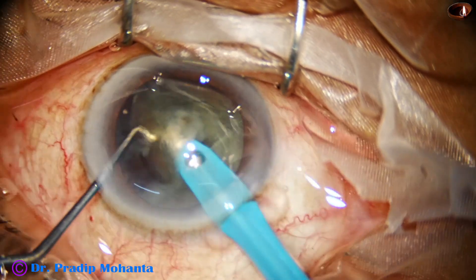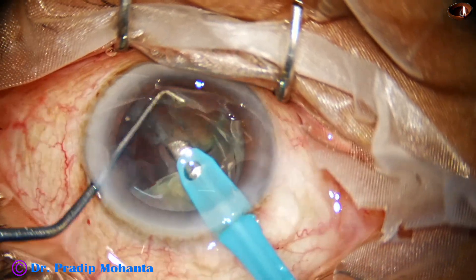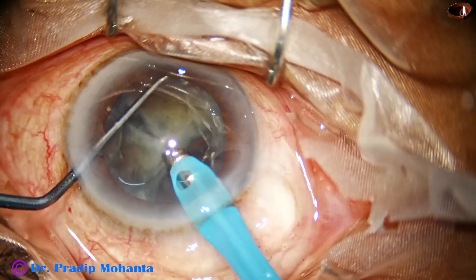Just take care of the anterior chamber depth and do this pre-chop. You will save a lot of ultrasonic energy, and it is going to be a safe surgery for soft cataracts.